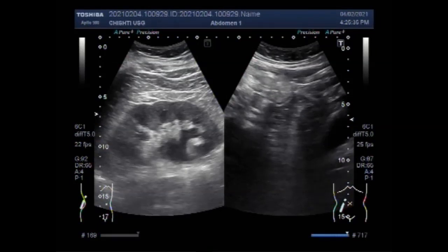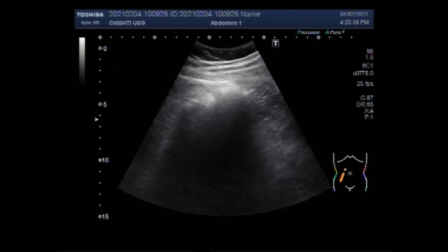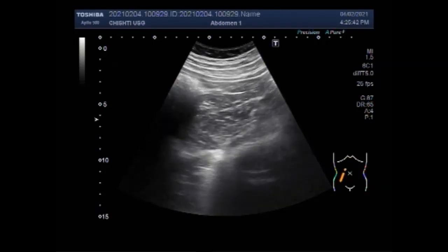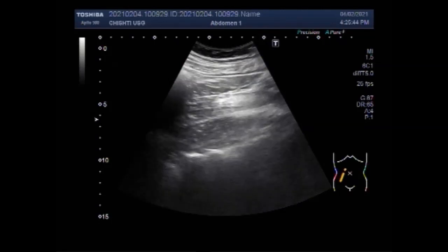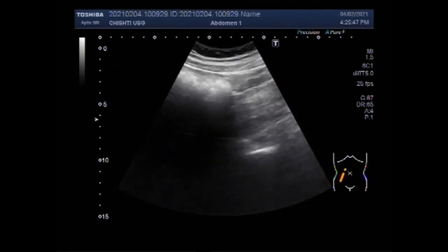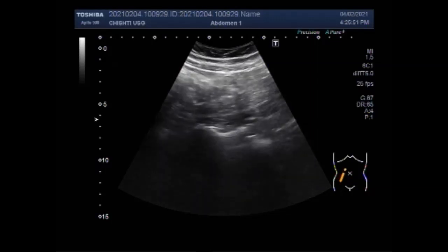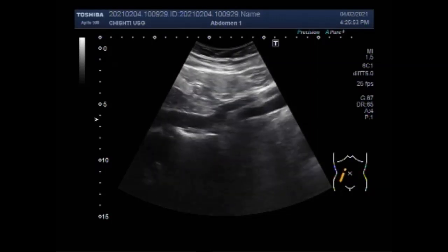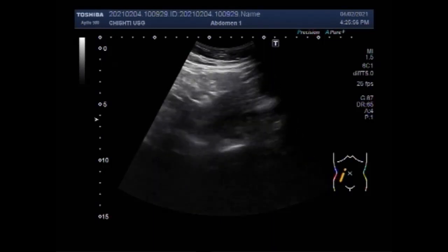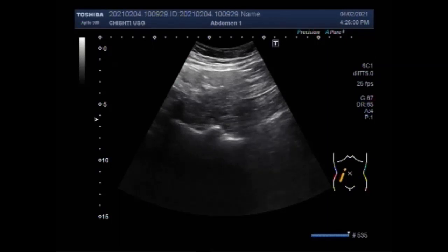Dear viewers, I hope you are all fine. This ultrasound video shows an Ascaris lumbricoides in the gut loop — a worm. This is quite an incidental finding. I was searching for a ureteric stone when I saw it in the right paraumbilical region.